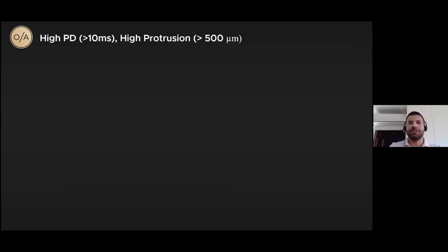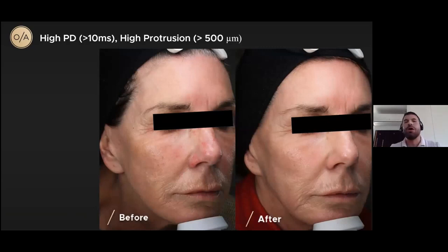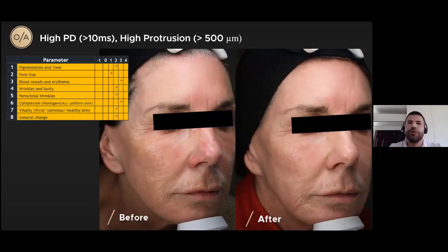While talking about the high pulse duration and the high protrusion, I want to share with you a new slide, so I've never shown it. I hope Ariono is in the crowd, between the participants. This is a study that we're now finishing. We're actually reviewing the results of the high setting of Tixel. Altogether, we have 44 photographs of 22 patients, so 22 right-sided pictures and 22 left-sided pictures. And I want you to try and appreciate what the changes are. So this picture, along with many other pictures, were sent to 4 non-involved dermatologists who had to rate the improvement.